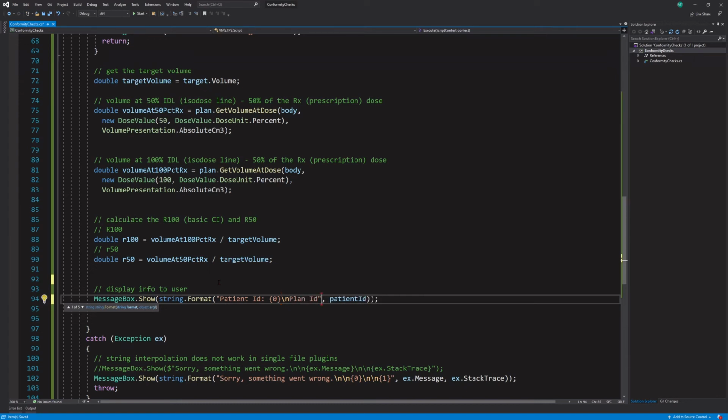plan ID, and then do, those are about the same length. So let's add a tab so we can space some of these things out some. Okay, and then let's add the next one. So the next one is 1, right? Because remember, it's 0 index, so we start with 0. And we want the plan ID.